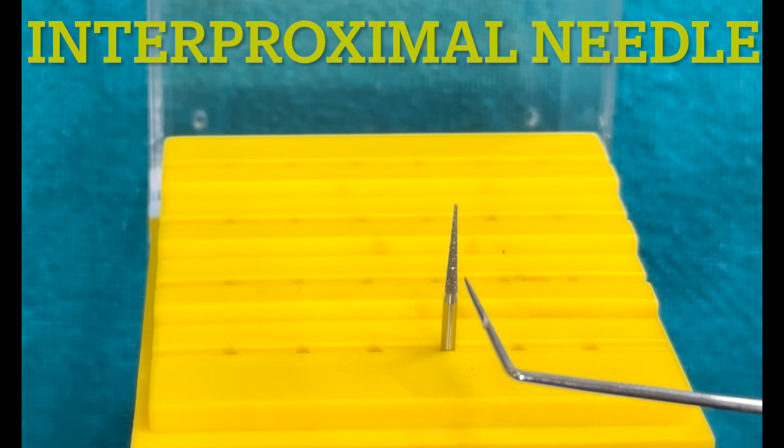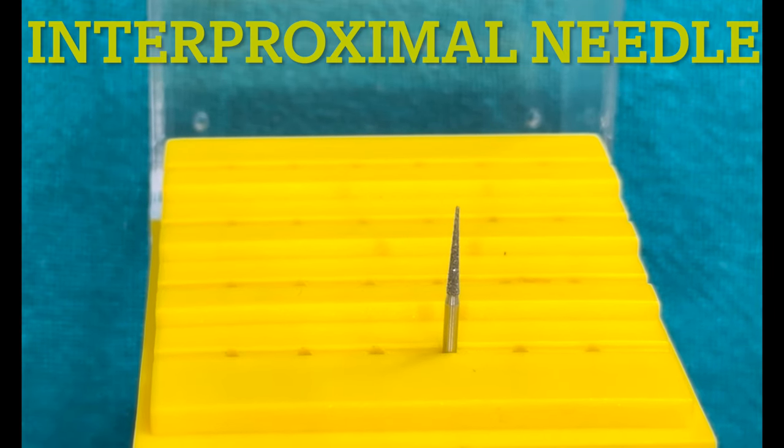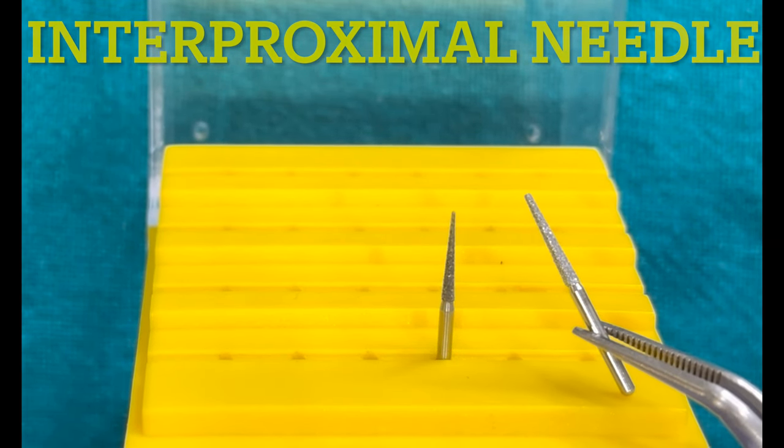This is an interproximal needle — you can see how sharp it is. It is used to remove the interproximal contact point. If you compare it with the flat and tapered bur, you can clearly see the difference in its sharpness.